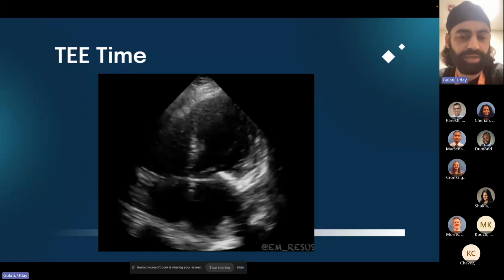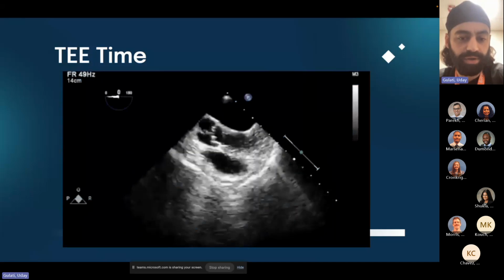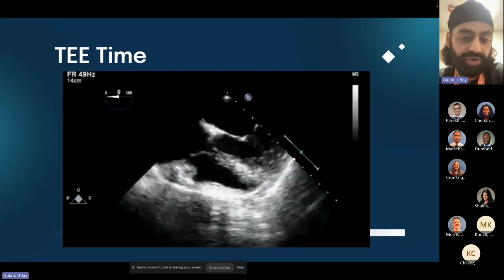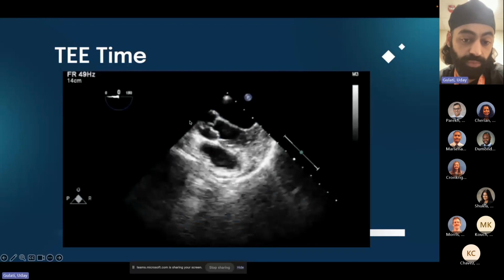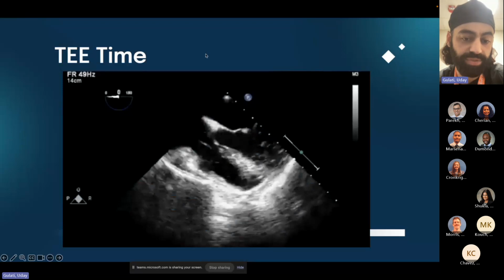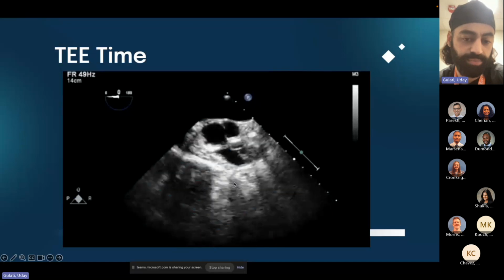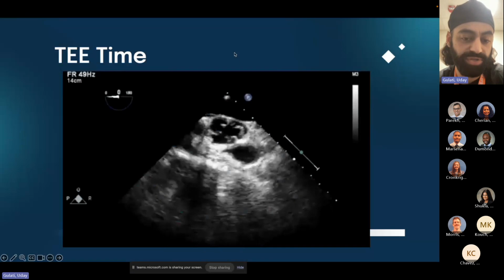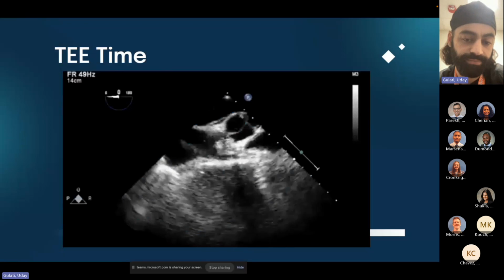And what we identify also is that in these patients where we start doing TEE in CPR, something you get concerned about is, are you compressing the left ventricular outflow tract, right? Maybe you're right over this area. This one, obviously, you can see opens up. As you compress, you can see it send blood flow out. But what if I was compressing in a way where I was going right past the septum here, in this axis, and I'm occluding my left ventricular outflow tract with compressions? Not worse, but they're ineffective compressions.